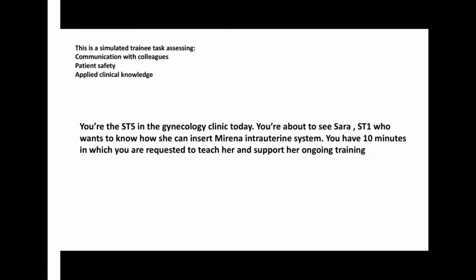When we sound the uterus, we need to know really how to insert Mirena. After insertion, inside the package of the Mirena coil itself, there is a patient information leaflet. You give it to the patient and tell her, this is an information leaflet for you, you can read it as you wish.